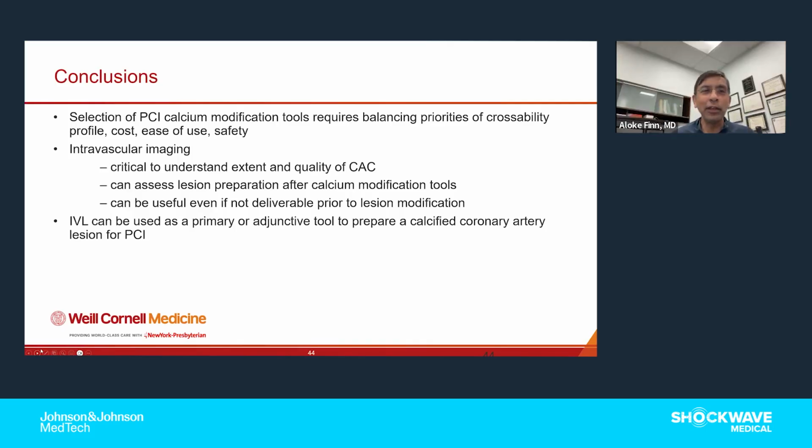Well, we've got two studies. They're not all being presented at TCT, but one Ziad really came up with. We're looking at the relationship of IVUS, OCT to fracture. Which is better? Are they the same? How good are they each at detecting fracture? And that goes back to your case, Jai. Obviously, we were looking at the reverberations.